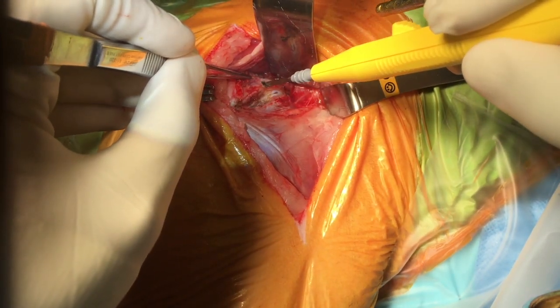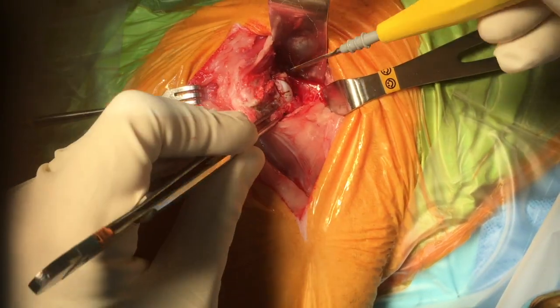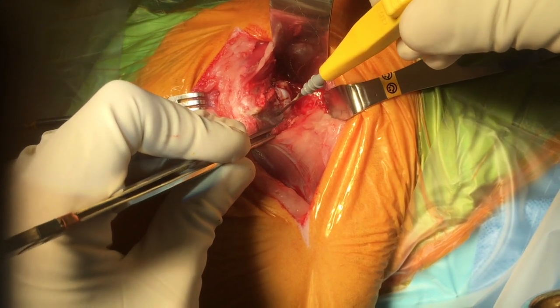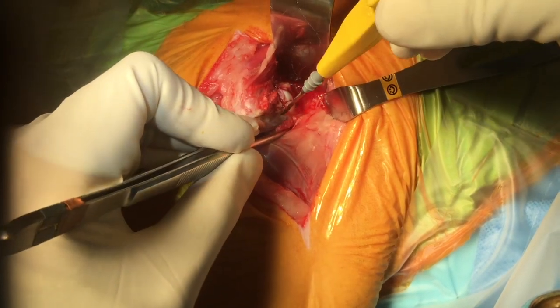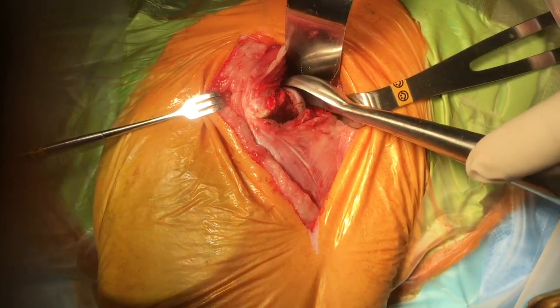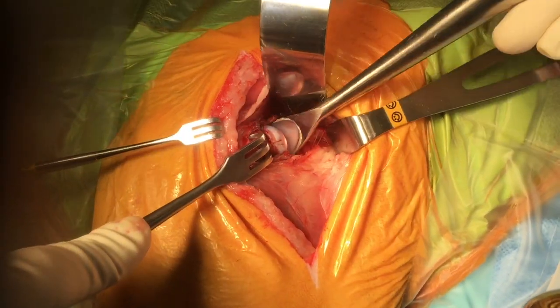Next, an incision is made into the joint capsule, combined with take-down of the vastus. A further perpendicular incision is made in the joint capsule dorsally. The joint capsule is then freed from the craniomedial aspect of the femoral neck, preparing for luxation of the joint with a spoon.